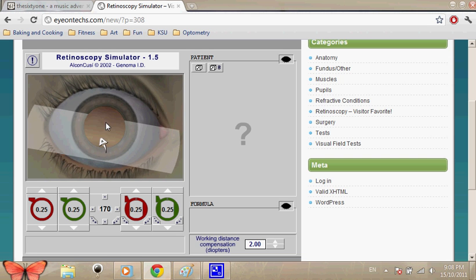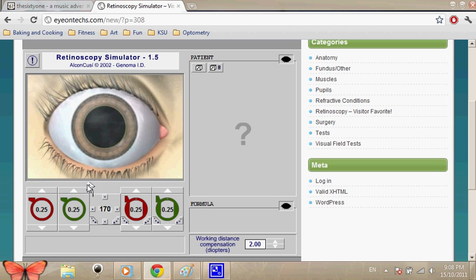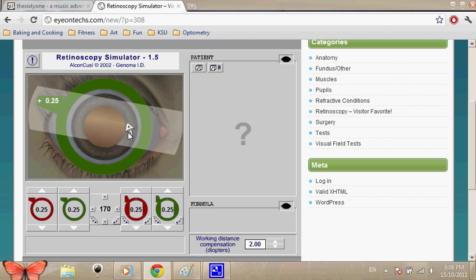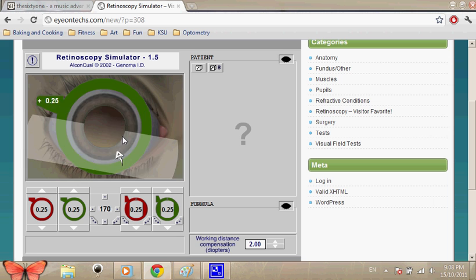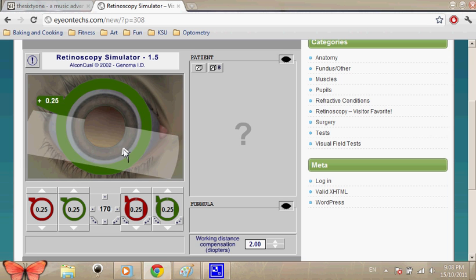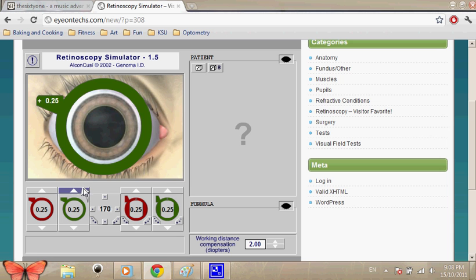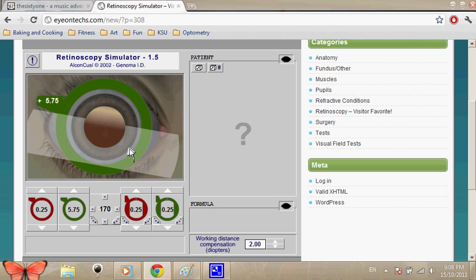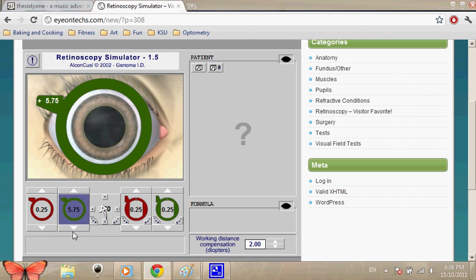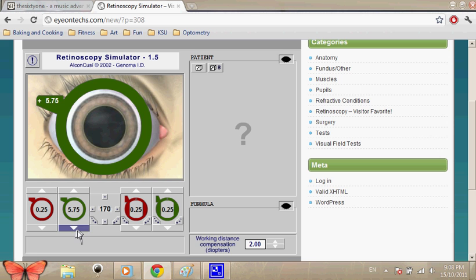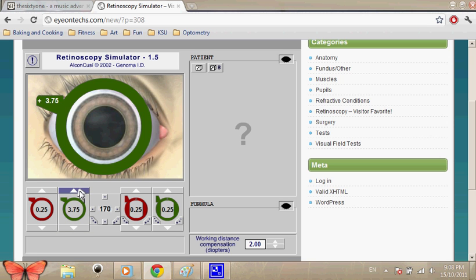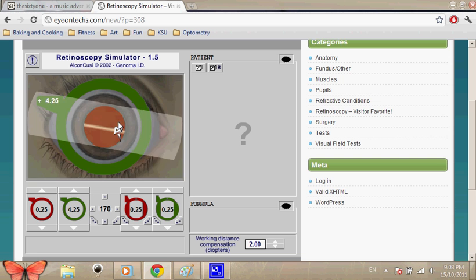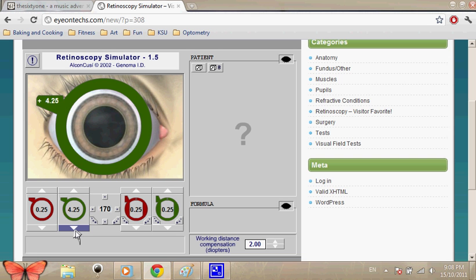Okay, we're going to add a plus, and I don't know if you can see this, but it's a little dim, so obviously it's a high hyperopia. So let's just go a little high. Okay, that's a little too high, because you see an instant motion here. Let's go a little further down. We've got with against, so it's 4. Hopefully we can get it.